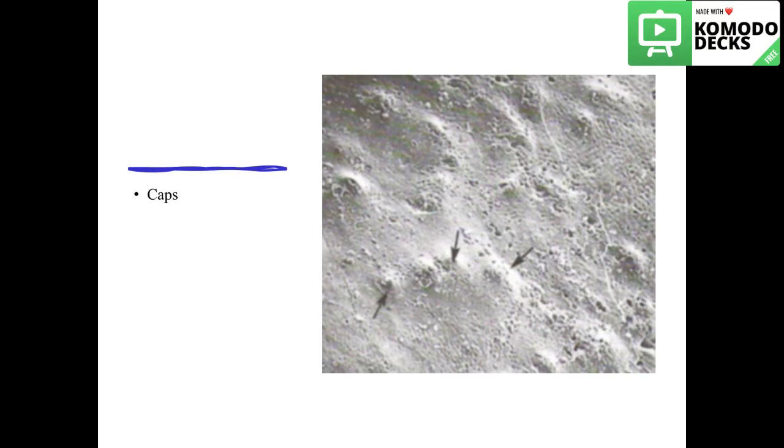Also, these small dots that are seen in the perikymata grooves and ridges are seen under the electron microscope. They are the prism end markings where the ameloblasts that secreted the enamel were actually sitting before they vanished. On the surface of enamel we can also see what are called enamel caps, which represent formation of enamel above some debris.